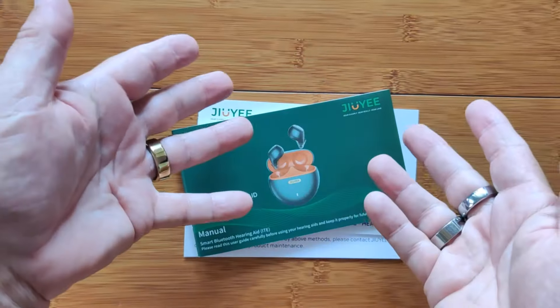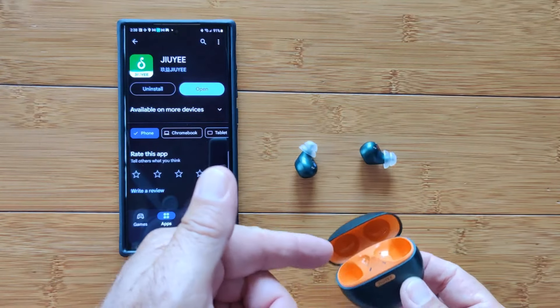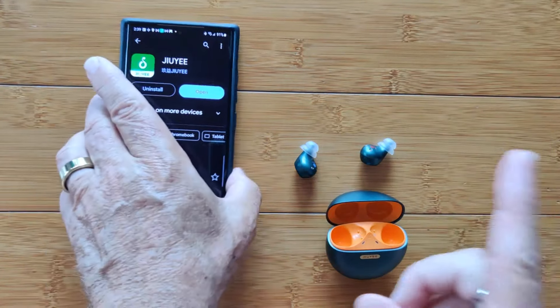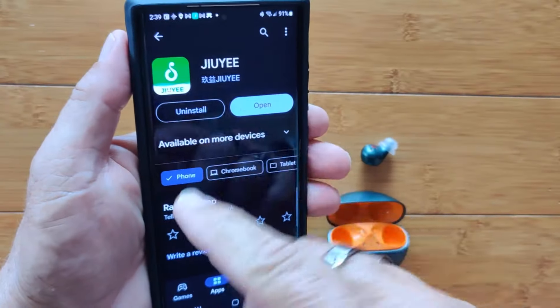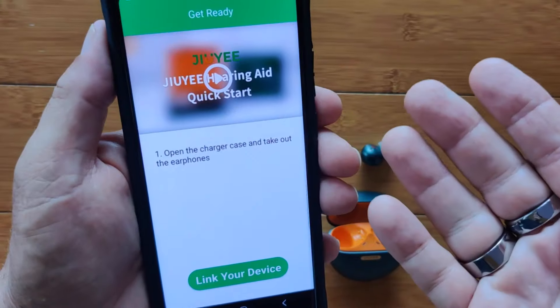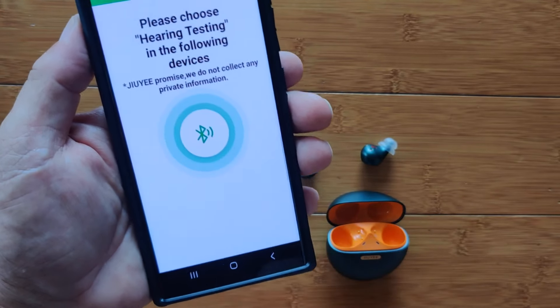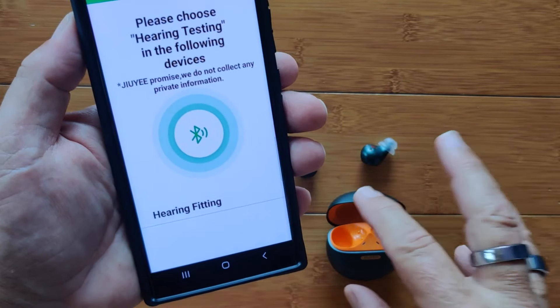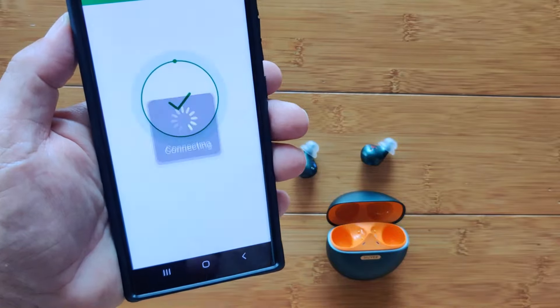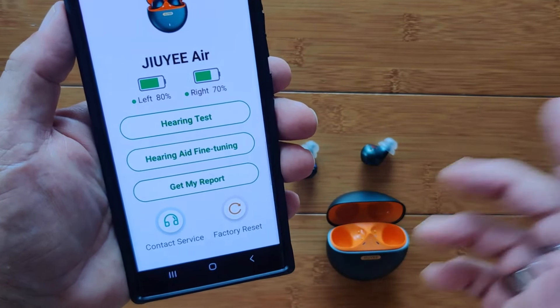To get them paired and working with the app, first take them out of the case and give them about 10 seconds. Put them in your ear and you'll hear a voice saying they're paired and connected — left and right. Then go into the app. From the Google Play Store, look for the JIUYEE icon. When you open it, you'll land on a page showing how to link your device — tap there, give it a few minutes, and when it says 'hearing testing,' that means it's seeing the device. Tap again and it'll connect the earbuds directly to the phone. It shows your power level and options for factory reset and contacting service.